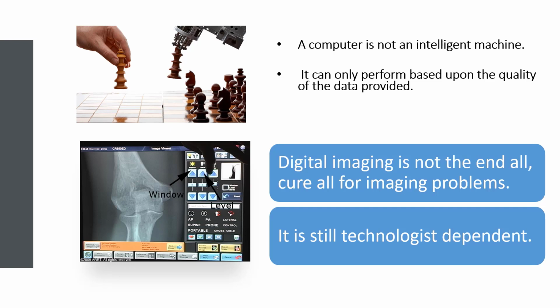A computer is not an intelligent machine. It can only perform based upon the quality of the data provided. Digital imaging is not the end-all cure for all imaging problems. It is still very technologist dependent.